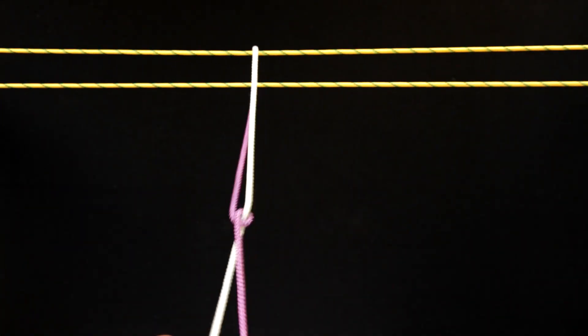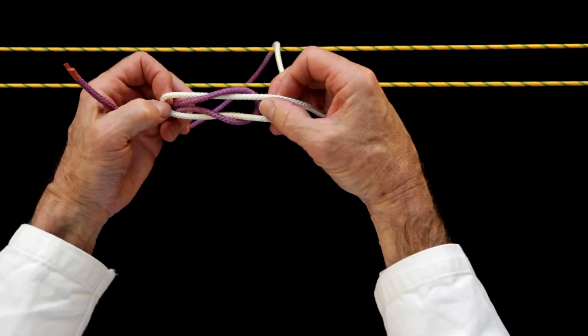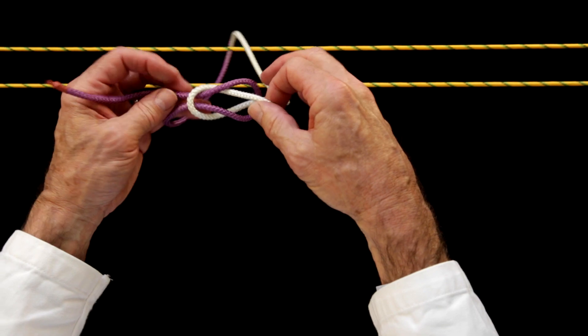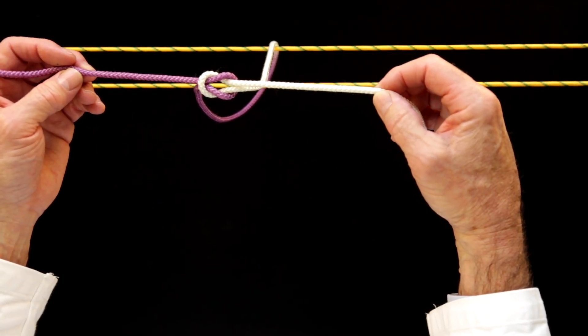Throwing two successive loops in opposite directions produces a classic square knot. Pulling on the two free ends of a square knot in opposite directions will tighten and lock the knot. Notice that all of the tightening occurs within the knot.